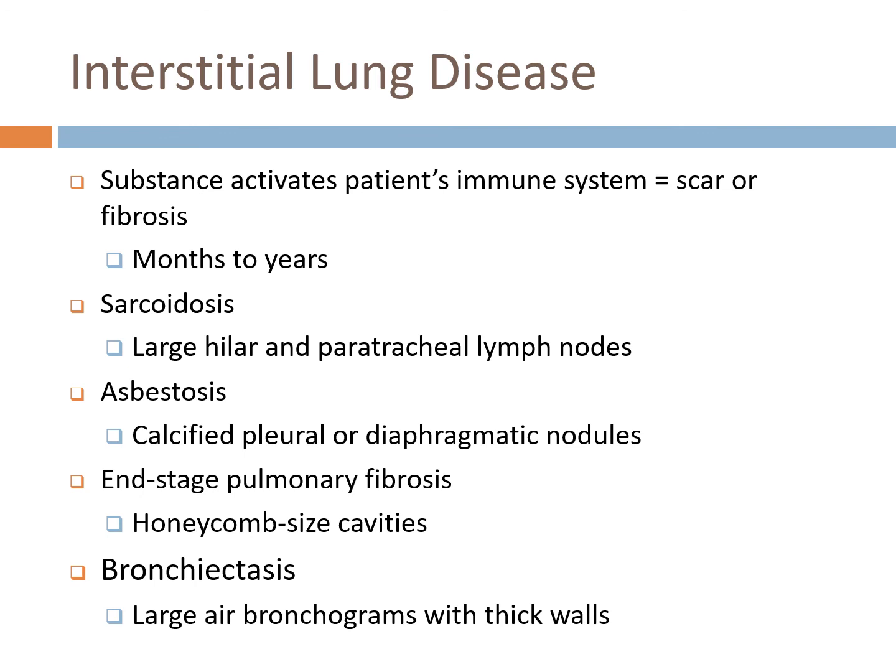I'm trying to see here what. So if you look at 206 and 207, you have a couple different things. You have more air bronchograms, and actually that's the one that we looked at earlier.